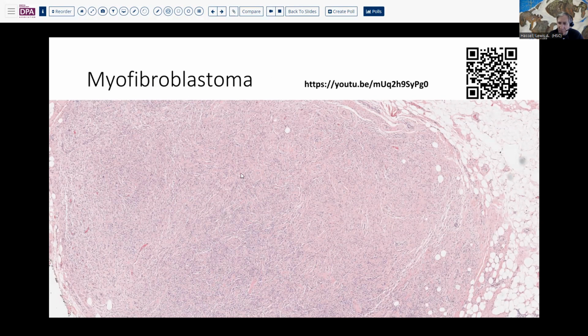It is often a mammary type lesion and tends to occur in the milk line most typically. We've given a previous video on this, the link of which you'll see here or in the cards. And here's a representative digital slide for you to examine.